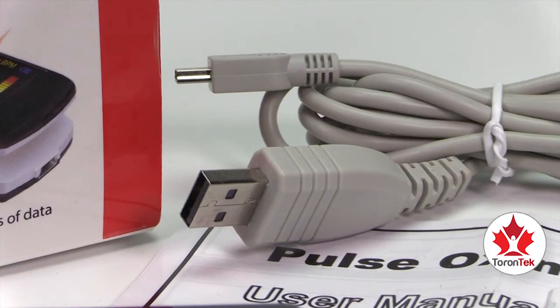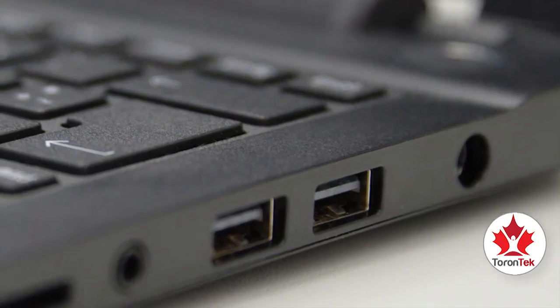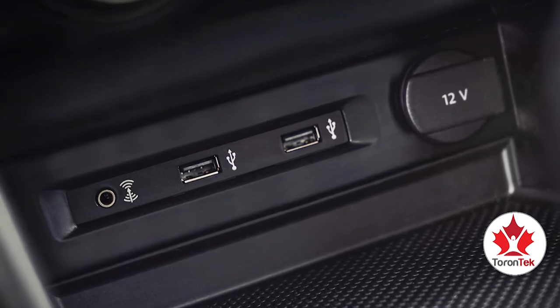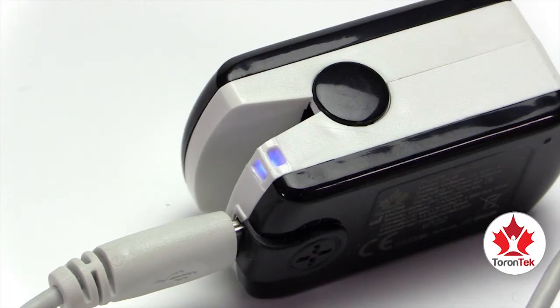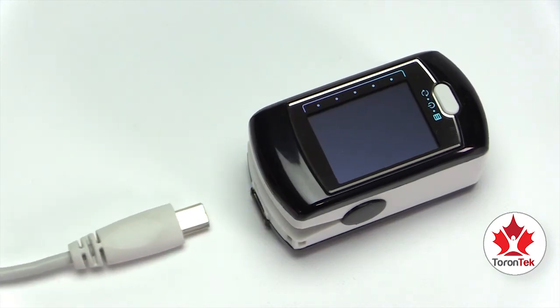To charge the device through a USB port, simply connect the USB cable provided to an available USB port on your PC, laptop, monitor, or even your car. Check that the charging light on the device is on. When the battery is fully charged, disconnect the USB cable from the device.